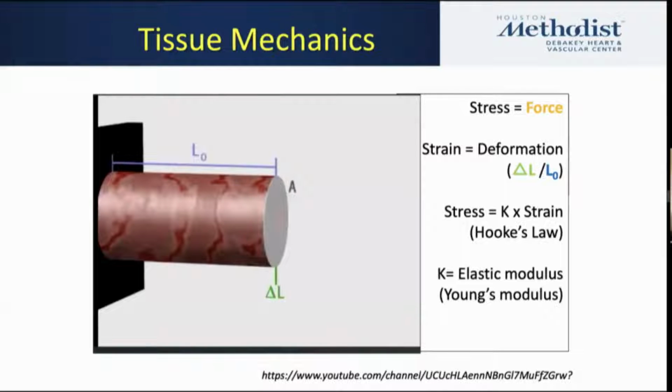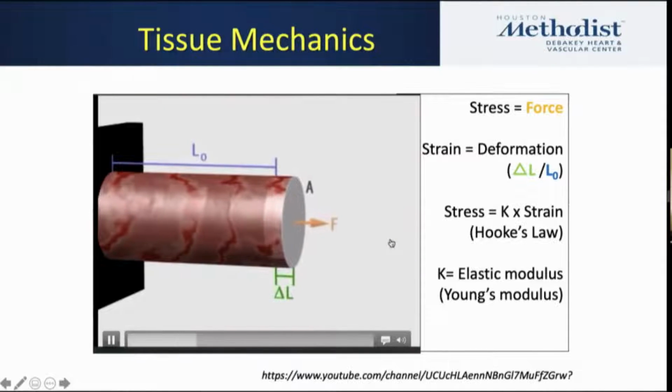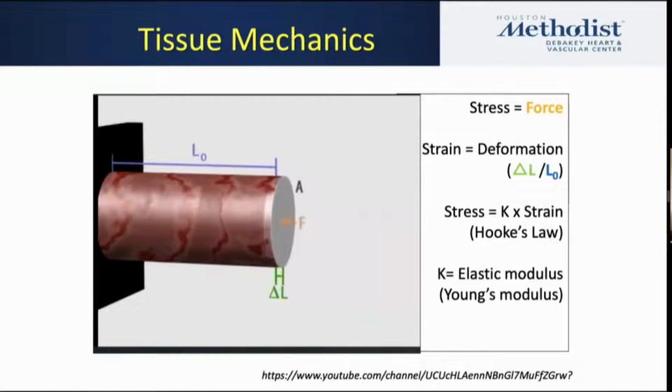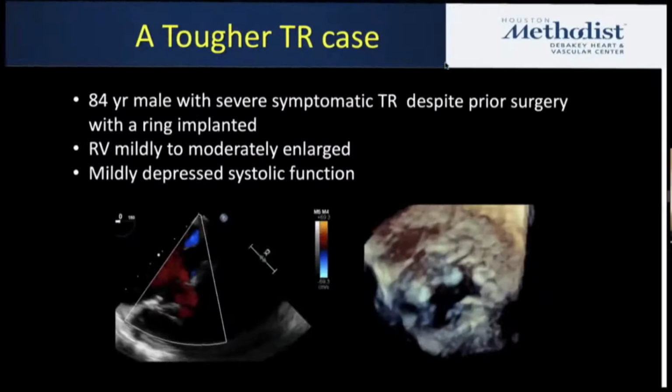Importantly, human tissues aren't rigid materials like that model. They have deformation that we know well from deformation imaging. So one of the fields now is trying to include both normal and pathologic tissue deformation, not only deformation from devices, but how devices deform tissue. So bringing that into the field is the next effort.